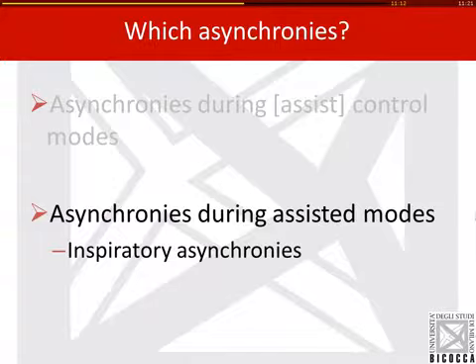So I would basically refer to pressure support during my talk, but many of the things can be applicable also to volume support or PPS, PAV, whatever.